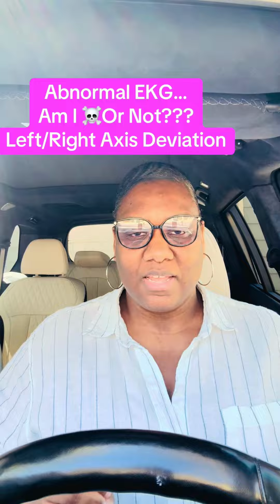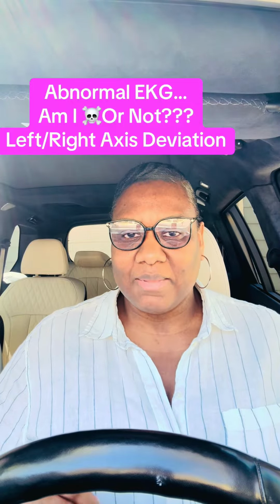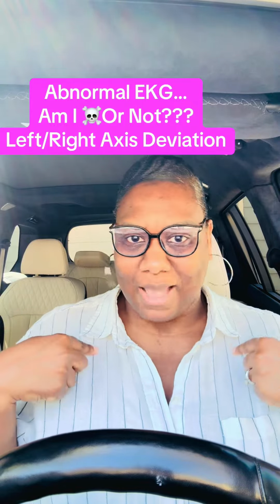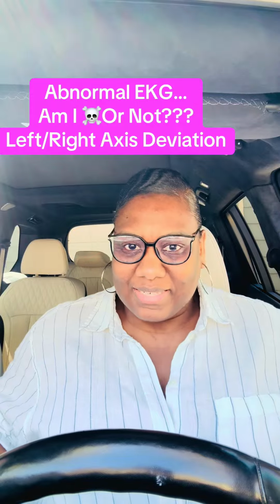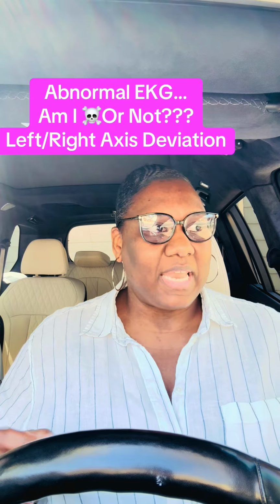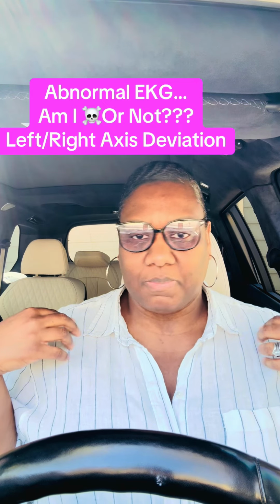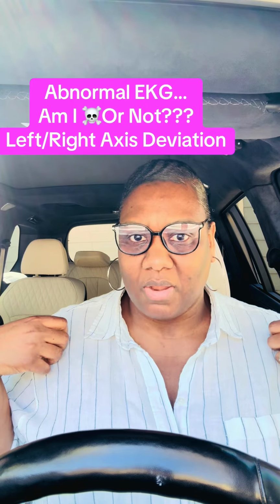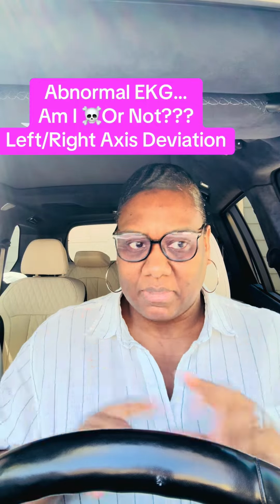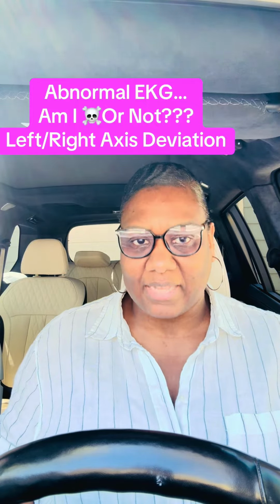Medical assistants, nurses, student nurses: limb leads need to be on the actual limbs, not at the top of the shoulders, not on the sides of the abdomen. They are called limb leads for a reason. Not just above the shoulder or just below the shoulder, close enough to the arm, so I'm gonna call it a limb lead. No. We put the limb leads on the actual limbs. That's my nugget for that.